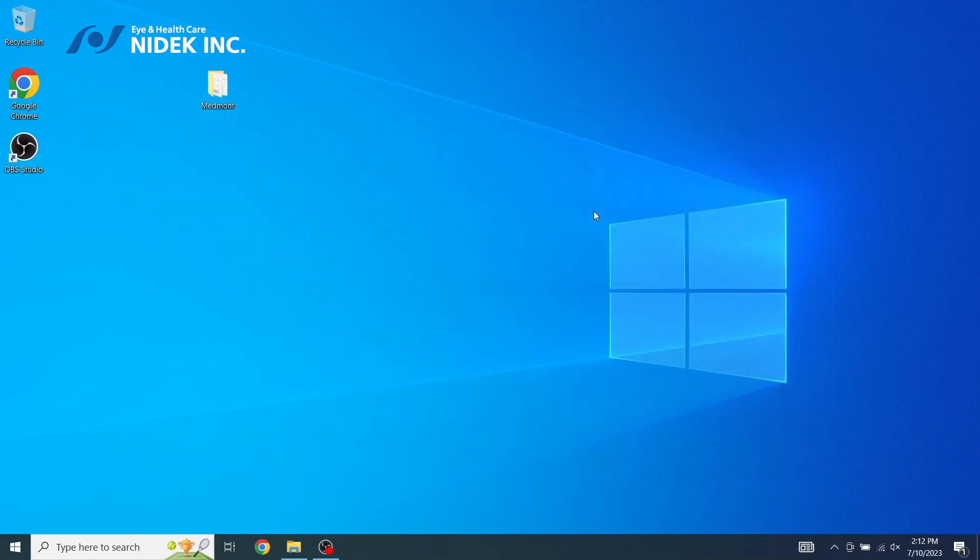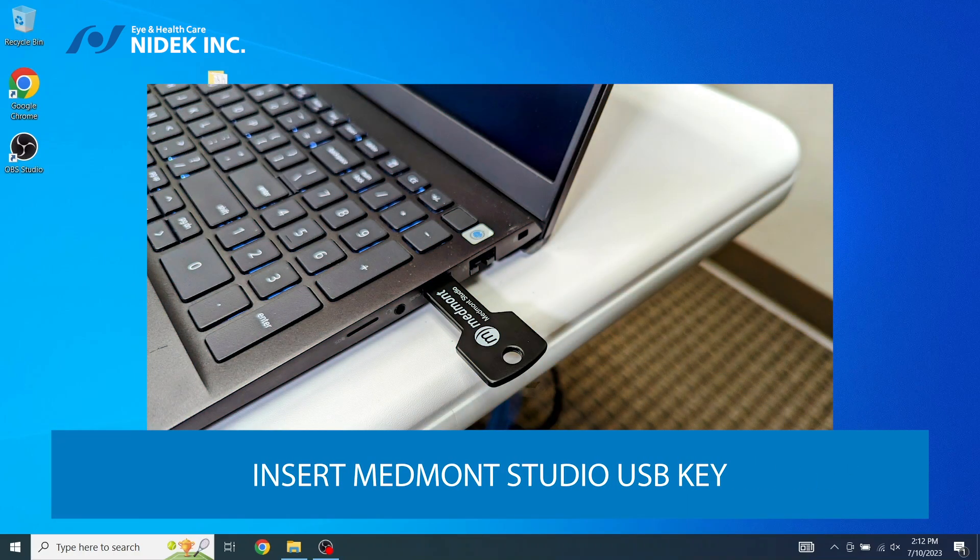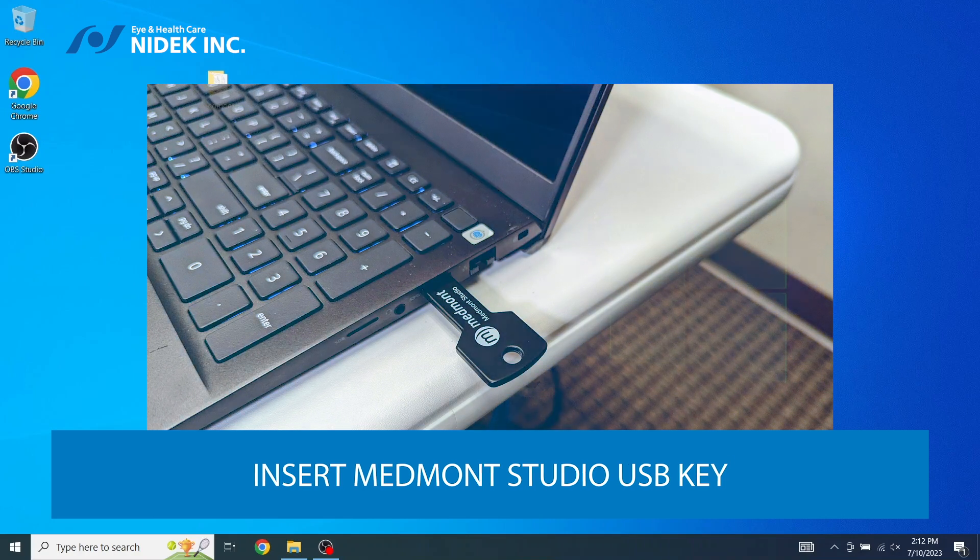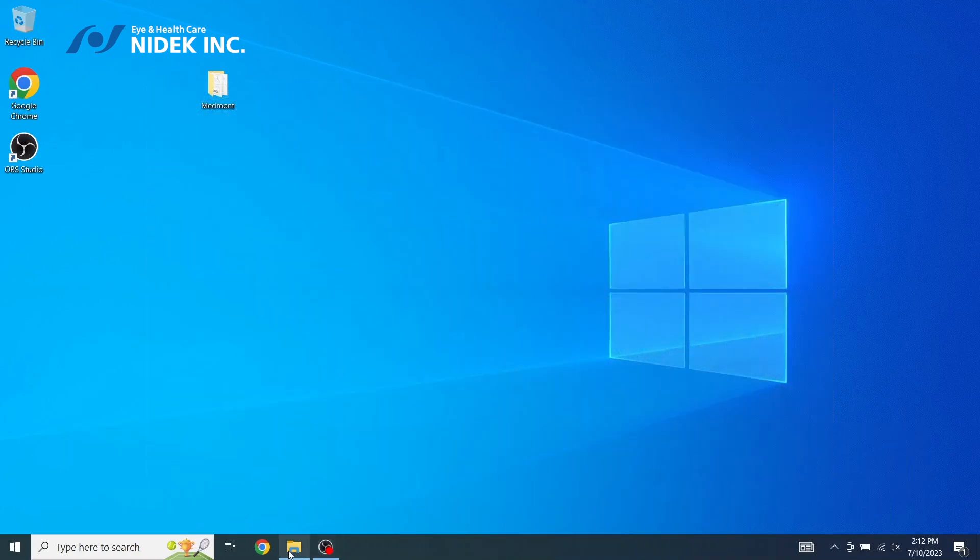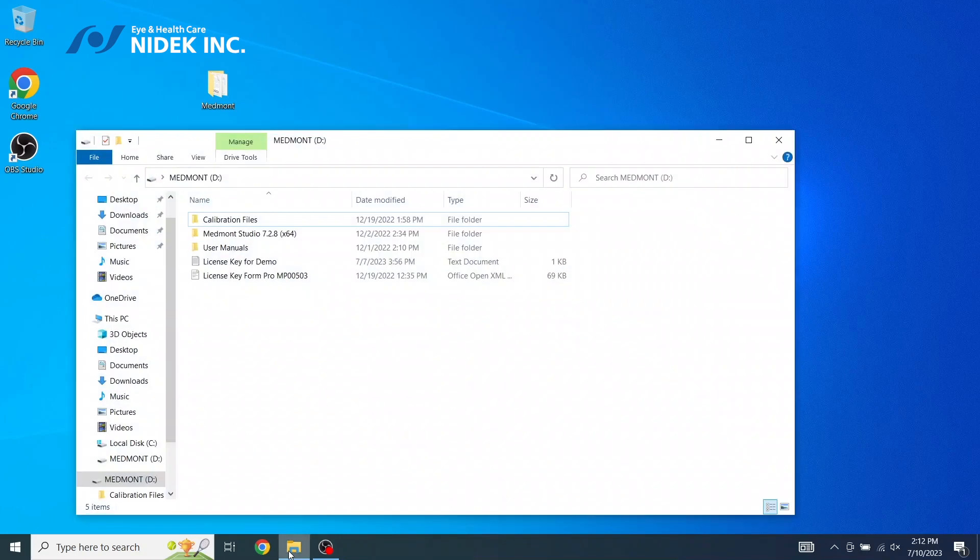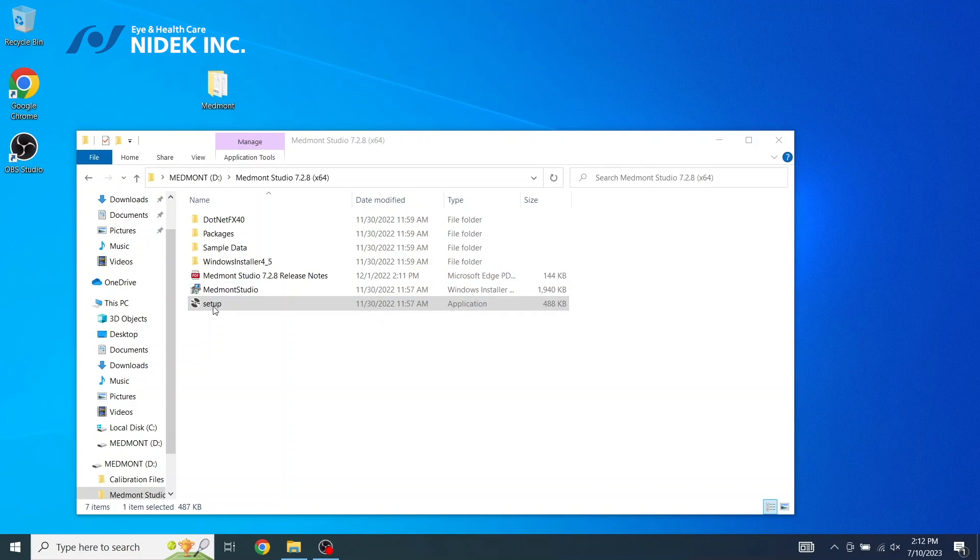You can go ahead and install or insert the Medmont Studio USB software key into your computer. After a few seconds, the Medmont file will open. We're going to select Medmont Studio 7.2.8 and select Setup, and then click Yes.